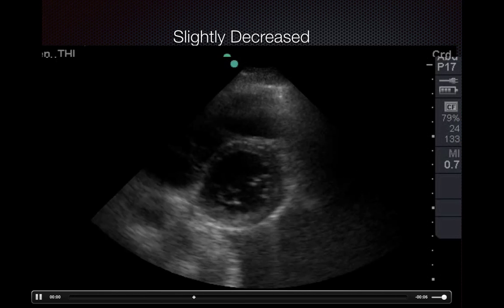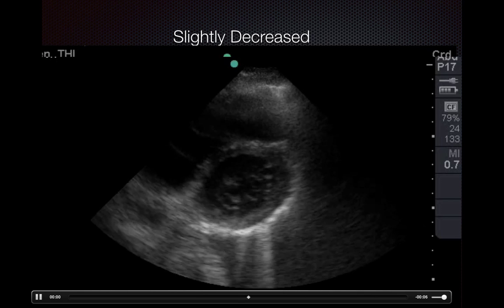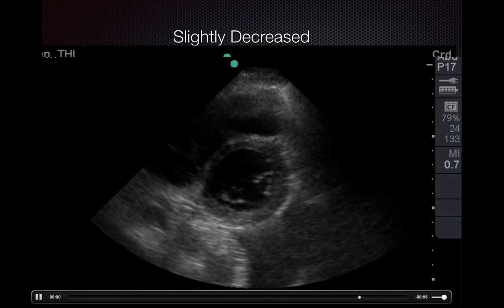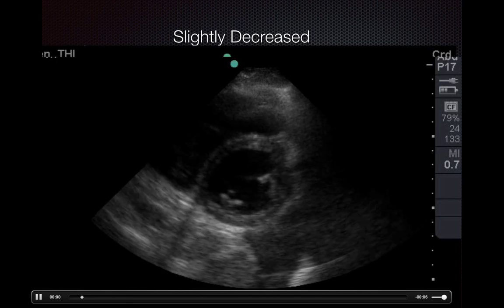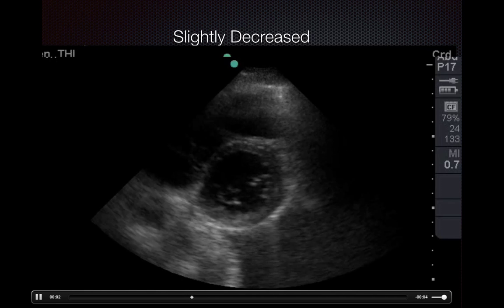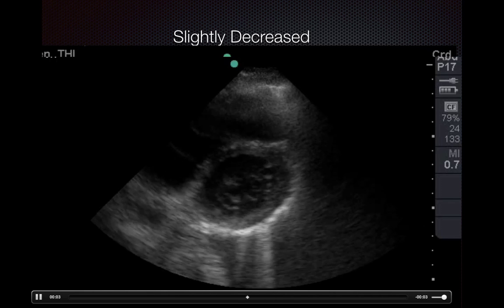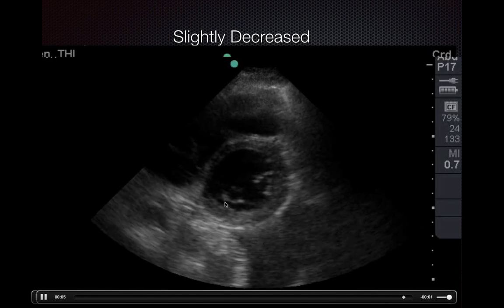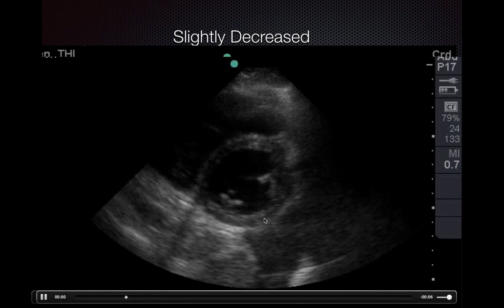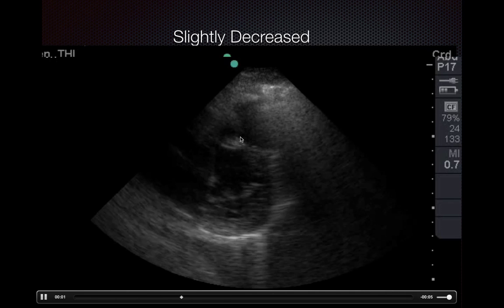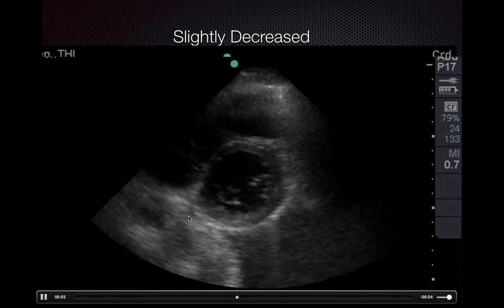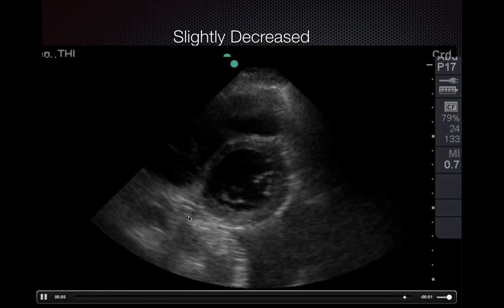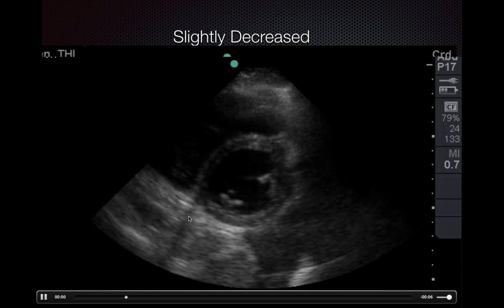Here is a parasternal short view of a heart with slightly decreased EF. You can see that the ventricular wall is not contracting symmetrically — it's thickening at different proportions — and the septum is much thinner and not thickening as nicely.